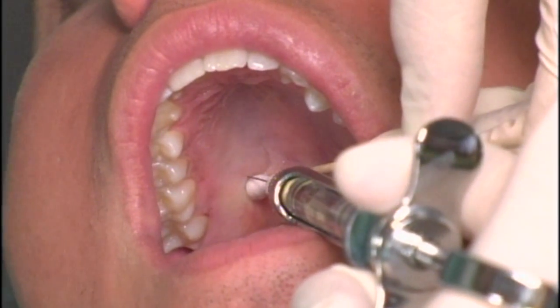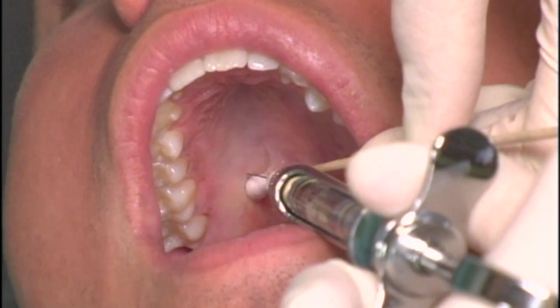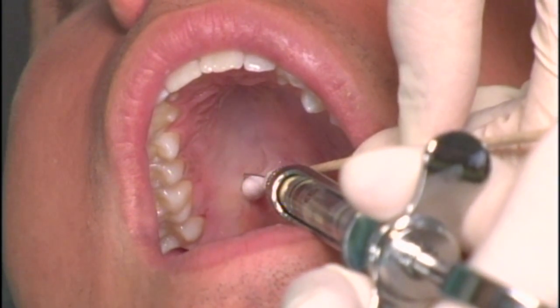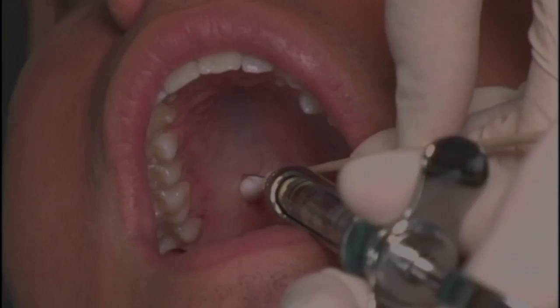On contacting bone and following negative aspiration, one-quarter to one-third of a cartridge of local anesthetic is deposited over 15 to 20 seconds.